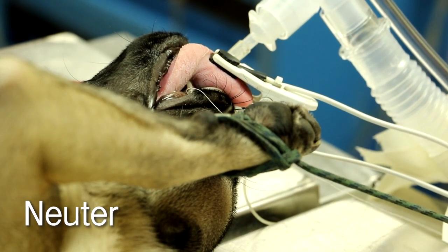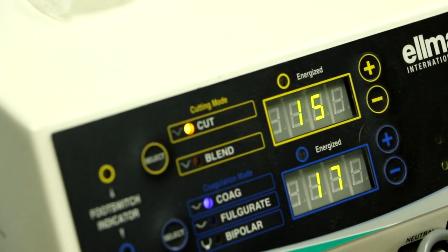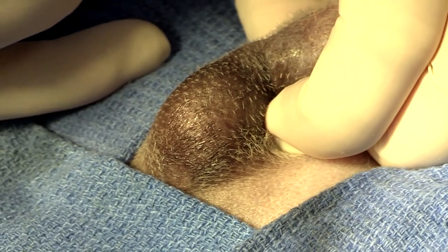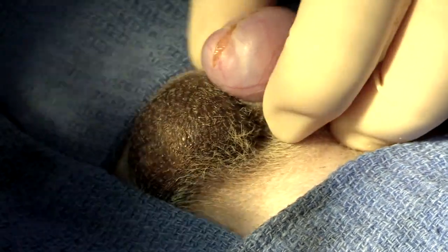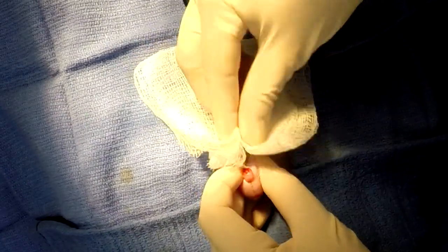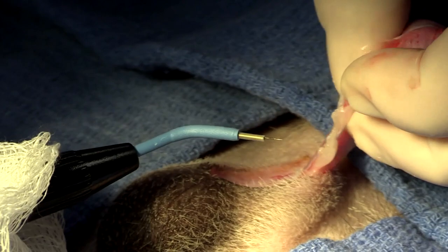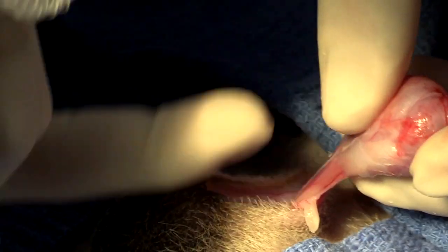In addition to the stenotic nares surgery on this guy, we're going to go ahead and neuter him at the same time. We're going to use the Elman as well, because that's just going to be a great way to control bleeding. I approach as a pre-scrotal, pushing the testicle forward, and I like to pull it up a little bit so I know exactly what I'm cutting. If you have a particularly pesky little piece of ligament, you can go ahead and isolate it from your spermatic cord. That's a beautiful thing to do because then you don't have excess bleeding — you can see minimal bleeding.